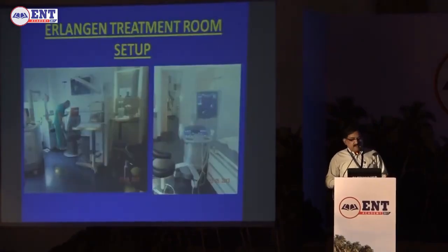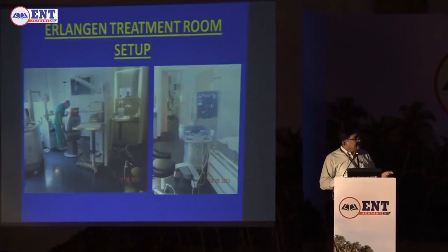So this is a treatment room set up in a university hospital in Germany, in Nuremberg. That place is called Erlangen, and it's actually one room. I made 2 photographs to link them. So here you have the microscope for seeing the duct and the orifice and dilating. I believe you need an operating microscope to see the duct orifice, dilate it, and introduce a scope.